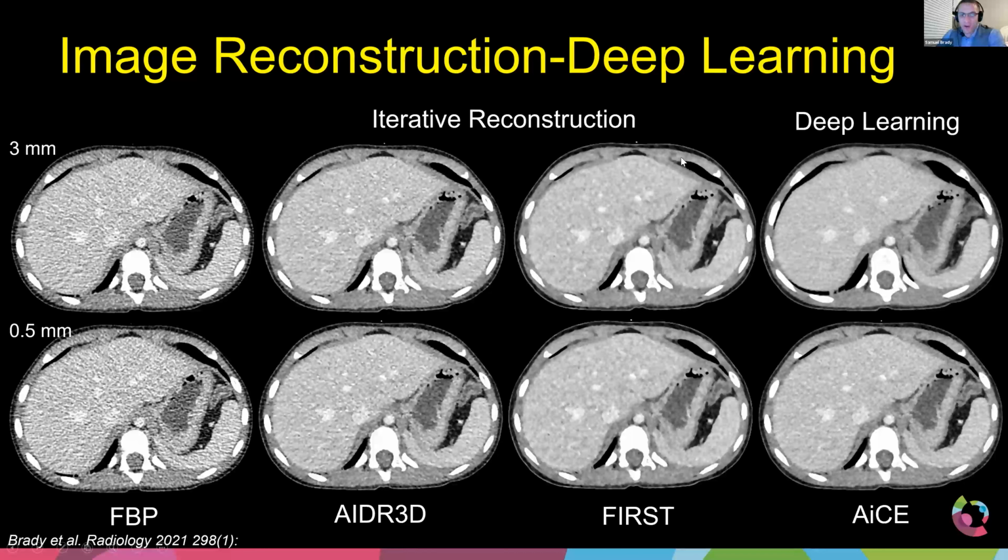And I would argue that this image is a little bit more coarse, it's blurrier. The pixels tend to be more blobbish, more smudged. And so the overall pleasing nature of this image is a lot lower compared to, obviously this is too noisy, but the edges are sharper and crisper over there. So what if we can just simply take that noise out, but not affect the edges? And that is what deep learning's done.